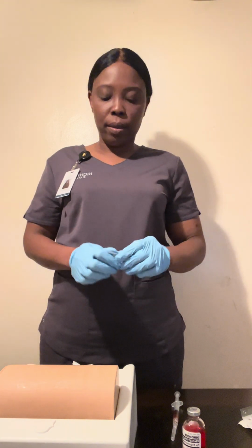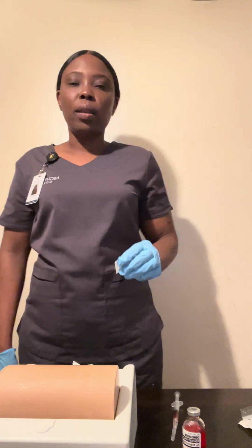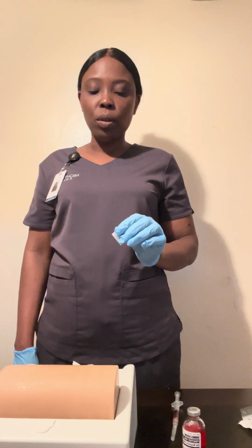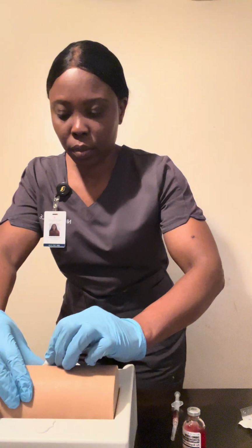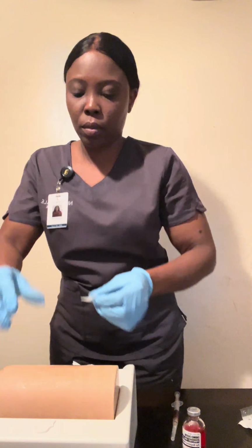to clean the site. I'm gonna do a circular motion from inside out, about 5 centimeters. And then I'm gonna let it dry without blowing or fanning.